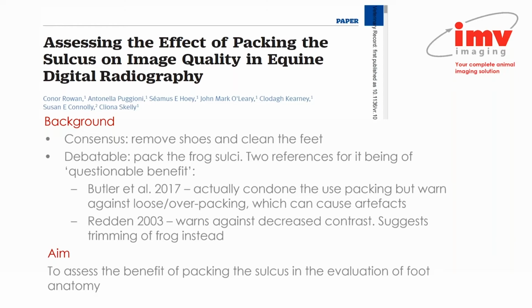The first was the Clinical Radiology or Radiography of the Horse by Butler et al. This was actually an inappropriate reference because the authors of this chapter actually condone the use, or they encourage the use, of packing the sulci of the frog, but what they do is warn against loose packing or overpacking, which they say can cause artifacts.